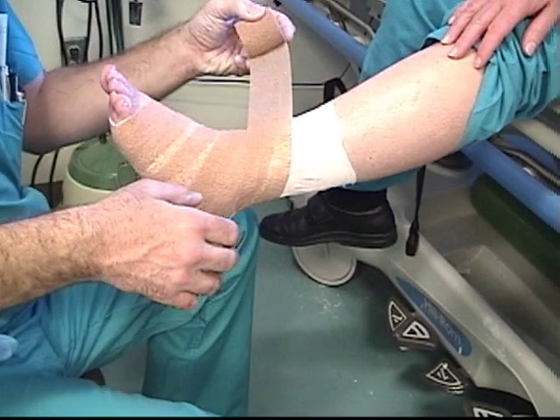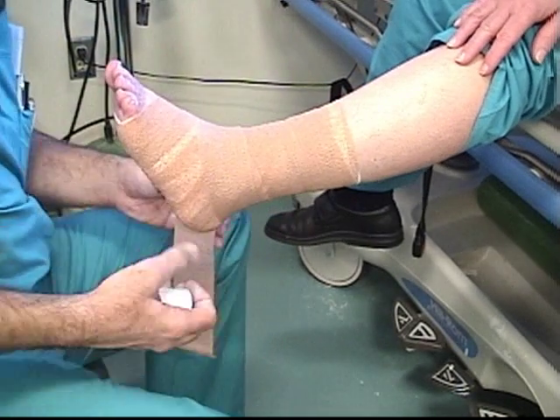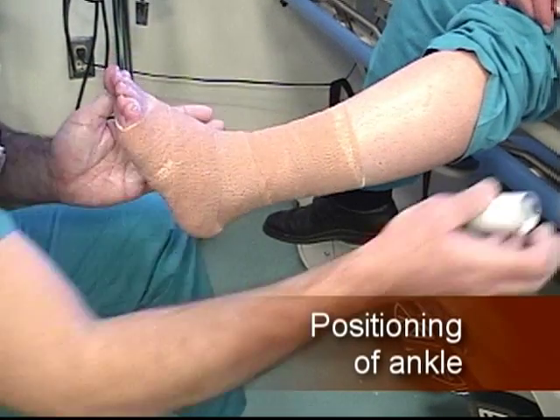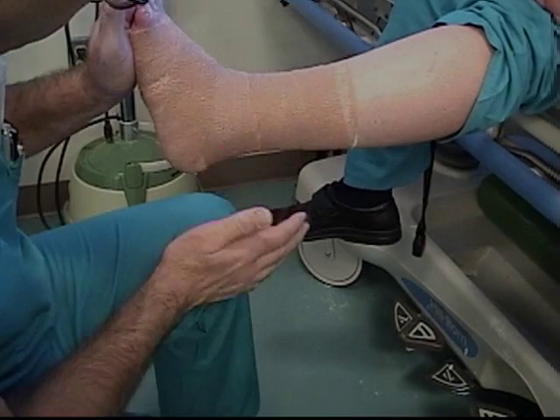Position the ankle at 90 degrees at the conclusion of wrapping. The Unaboot dries slowly over the next 24 hours and provides an occlusive dressing to the lower leg and foot that can remain in place for five to seven days.